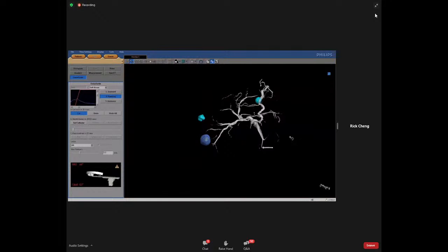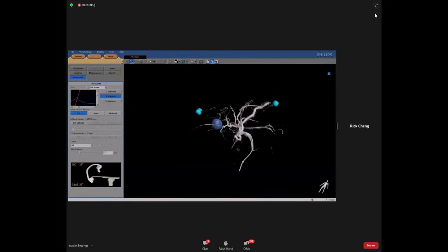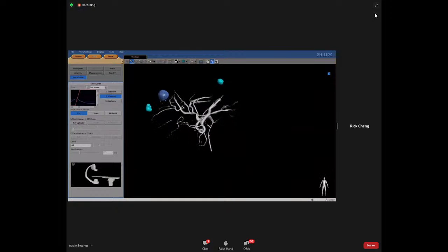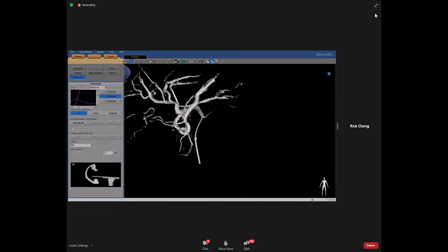The next step is to identify the catheter. Rotate the volume to obtain a clear view on the catheter. Select the Set Catheter button and move the mouse pointer to the catheter in the 3D volume and click on it. A green dot is placed in the catheter to identify the position. Notice the Set Catheter button has now changed into the Add Feeder button.